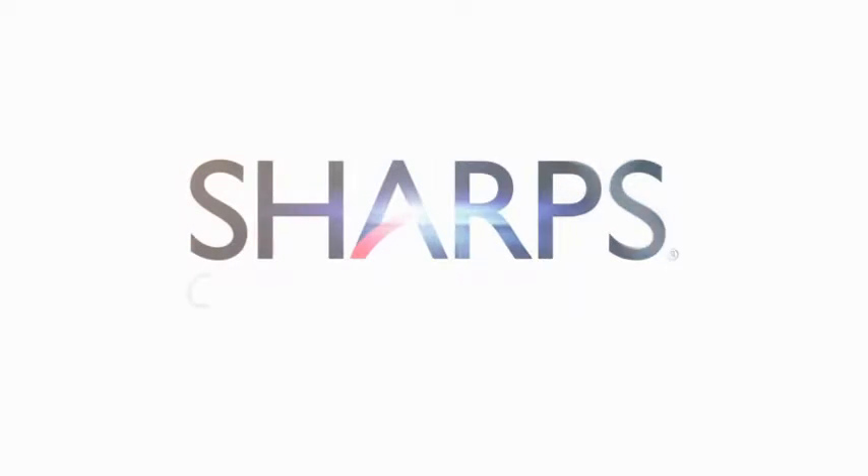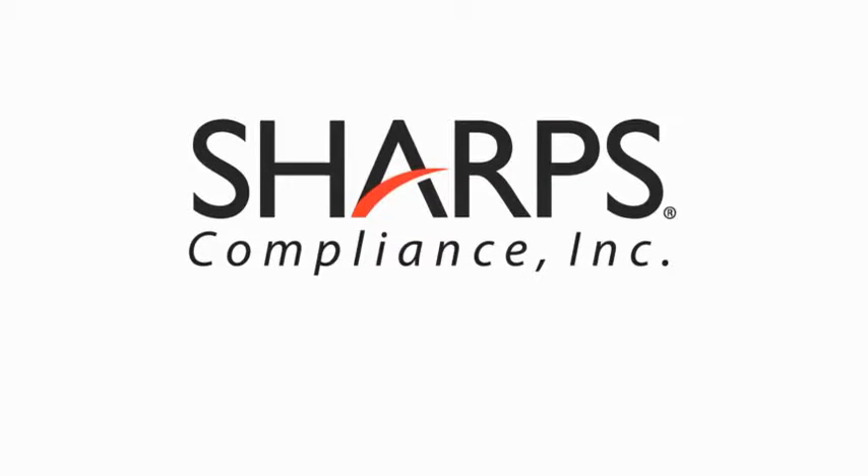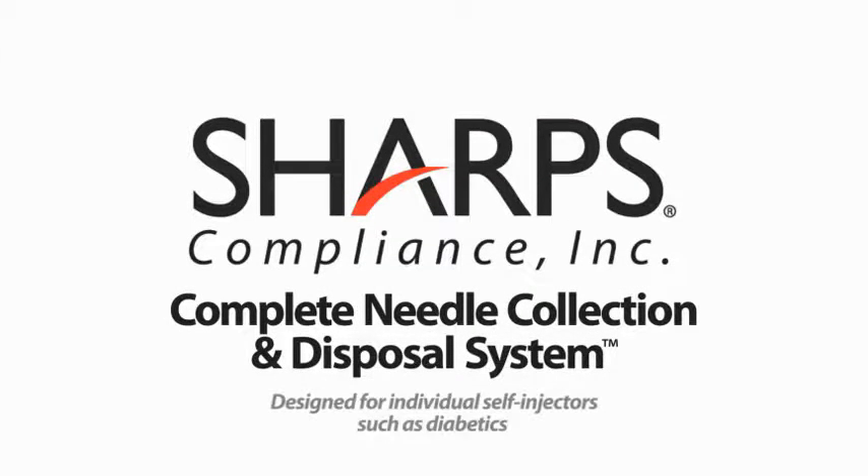Thank you for choosing the Complete Needle Collection and Disposal System to properly contain and dispose of your sharps, which include needles, syringes, and lancets.